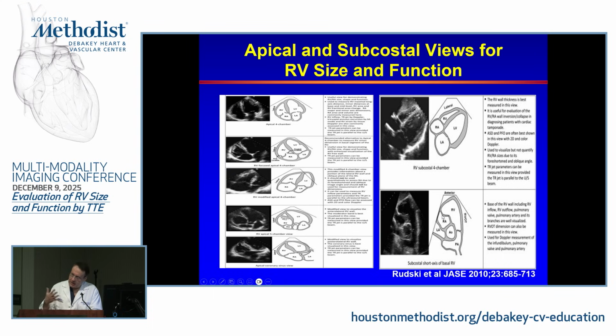So you see there is a lot that can be and should be included in the exam that we can rely on to see the different segments of this right ventricle.